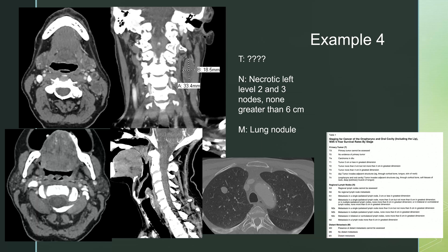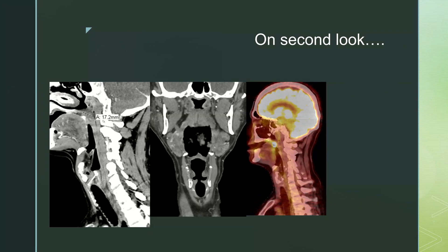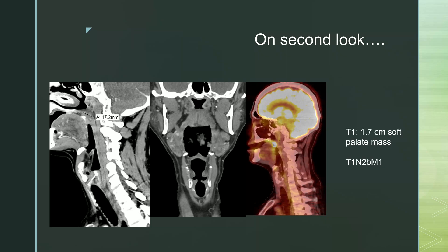With unknown primary cancer, we proceed to PET scan. On second look, we see uptake within the uvula and soft palate — the uvula is actually the primary source of the tumor, measuring approximately 1.7 centimeters in maximum diameter. So our final staging after the PET CT is T1N2BM1.